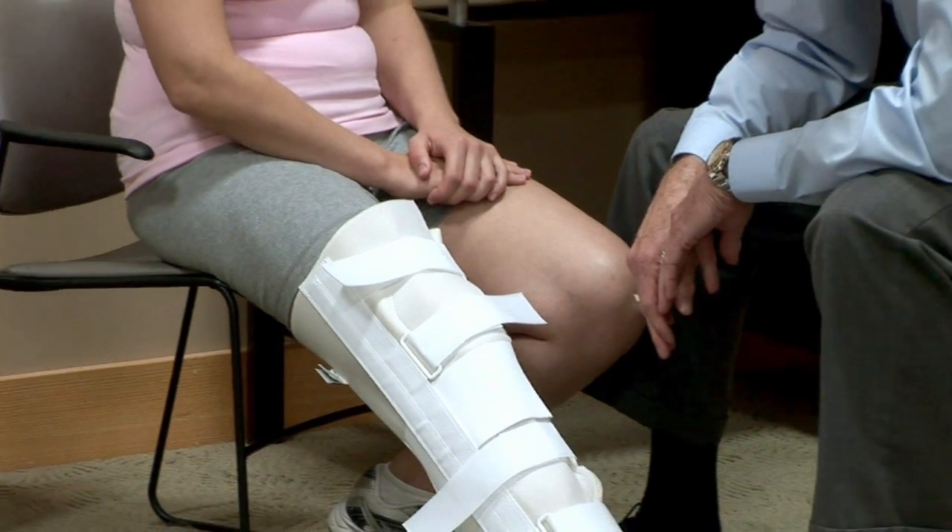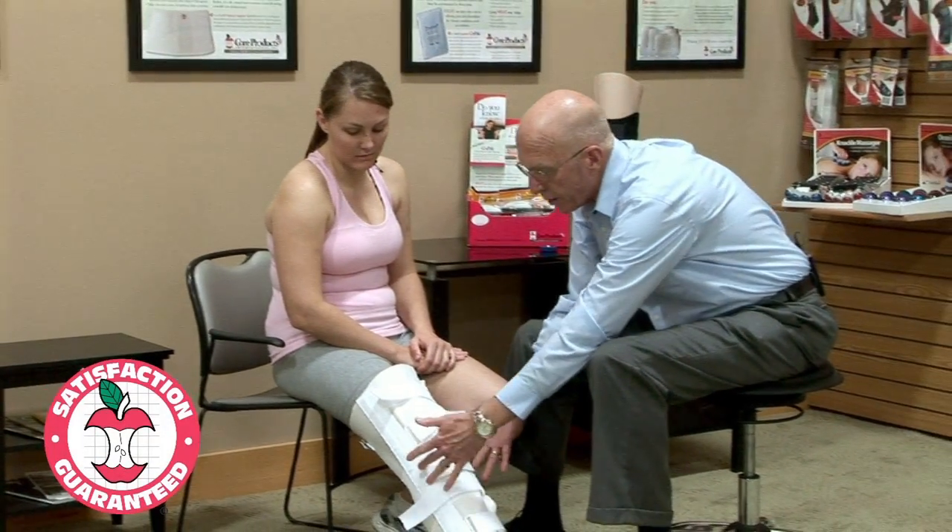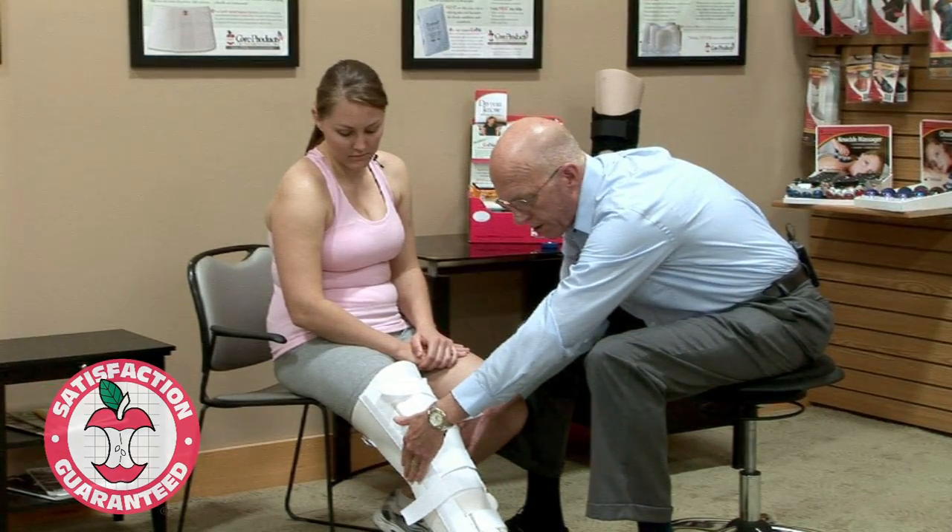That would be the application of a universal knee immobilizer. As the leg gets smaller, the sidebars can be removed and repositioned so they're very lateral and very medial.